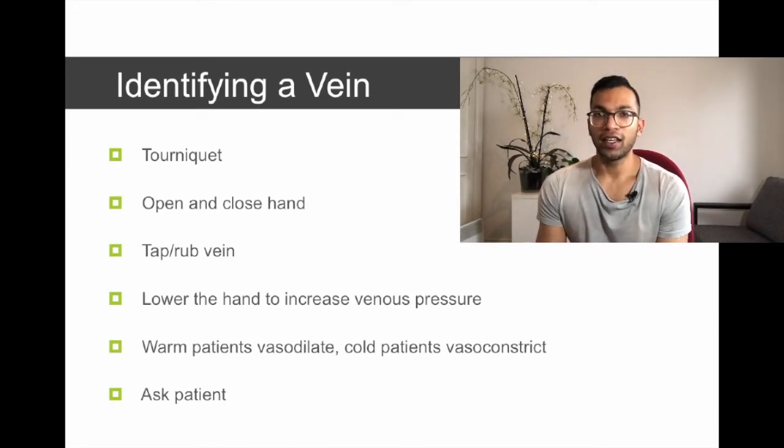Sometimes you just won't be able to find a vein. Seemingly you cannot find a vein no matter where you look.